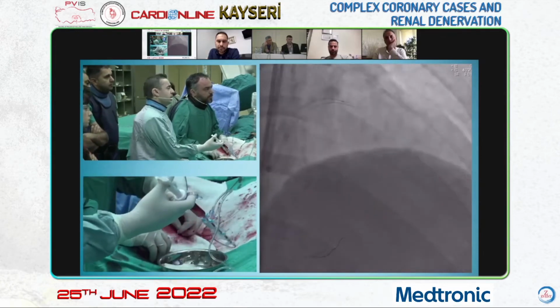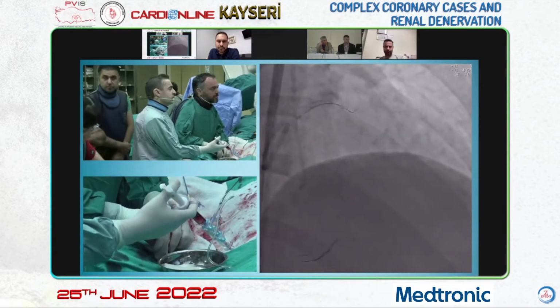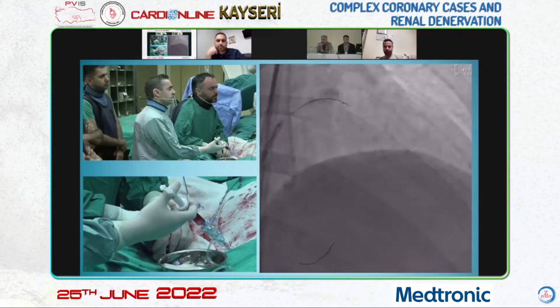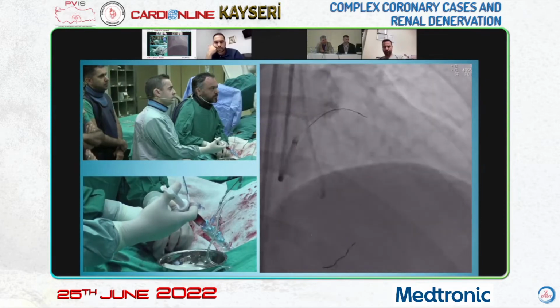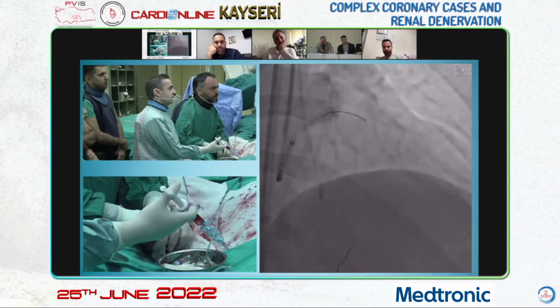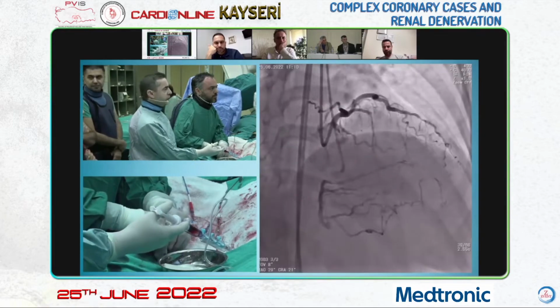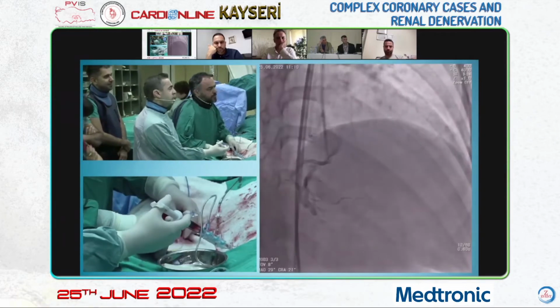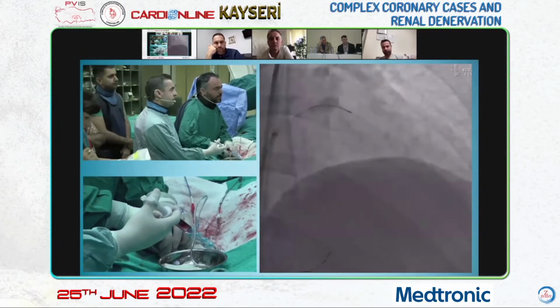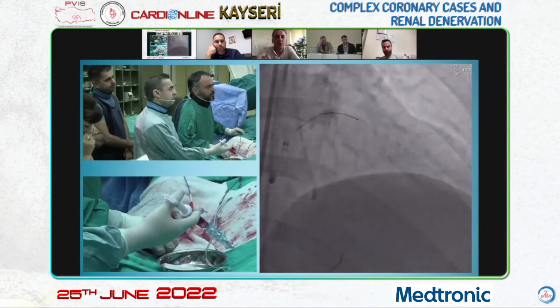Penetration is forcing. We cannot penetrate right now, unlike our expectations. I would think that there would be an obstruction, but I think we couldn't get the area in the first operation. Penetration is a good wire. The weight is around 4 grams. Your guide seems to be backing out. You can increase the backup.